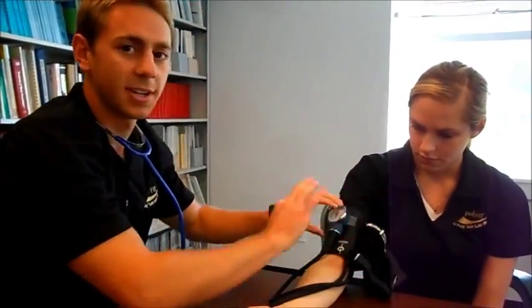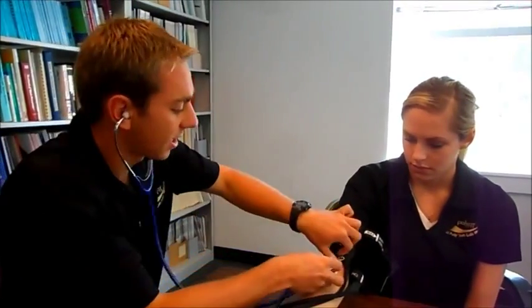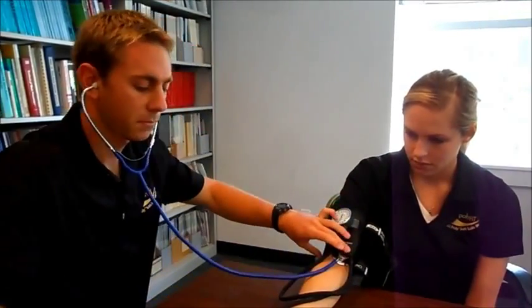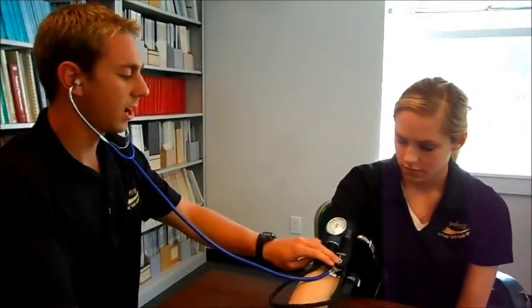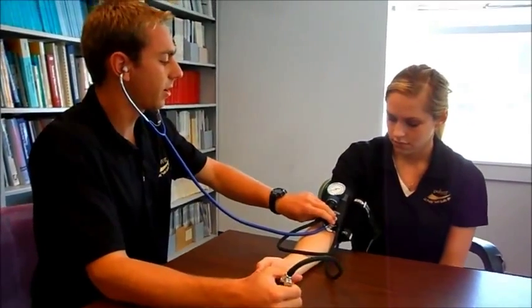Place the head of the stethoscope right where you found the pulse, double-check that the valve is all the way tight, then squeeze the pump to push air into the cuff.